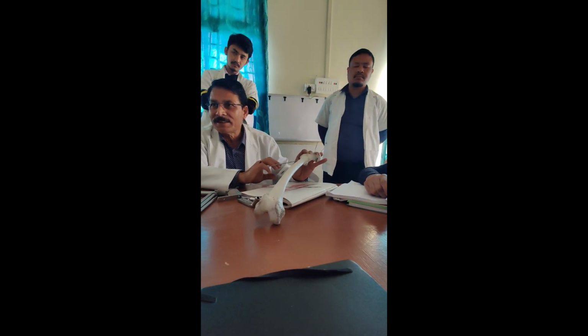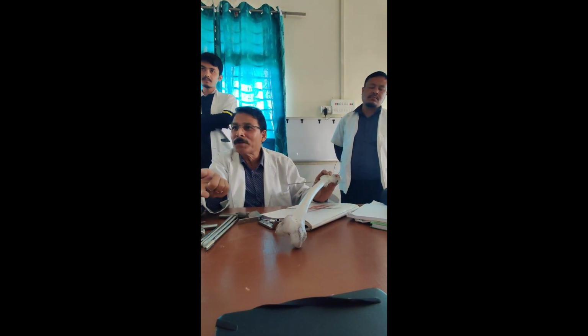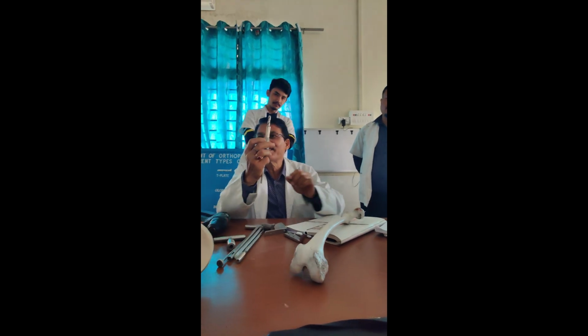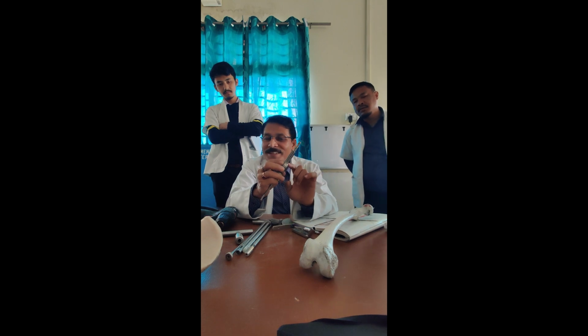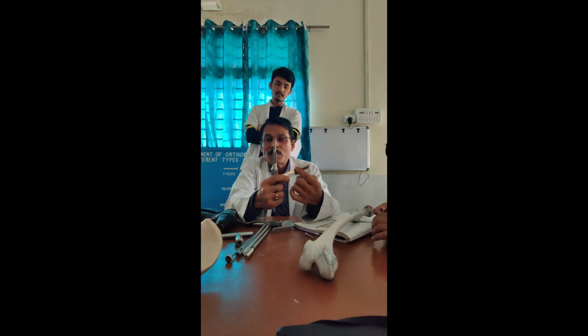Now my job is what? This is okay. We have confirmed that my guide wire is in a bullseye. Everything is fine. Now the next thing is you go for the reaming and other steps. What is the reamer known as? Why is it called a triple reamer? This is 8, this is 12 mm, this is 23 mm. Why is it important? To accommodate different parts, most importantly the angle. This should be accommodated.